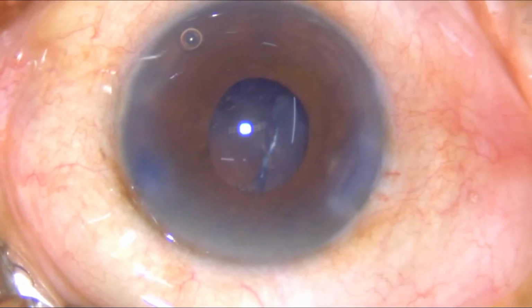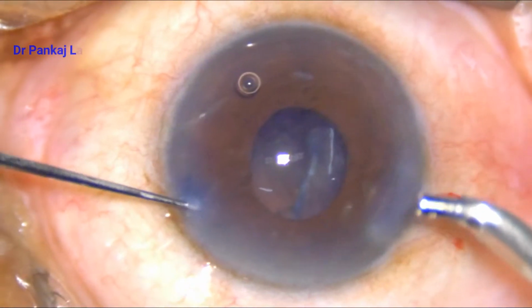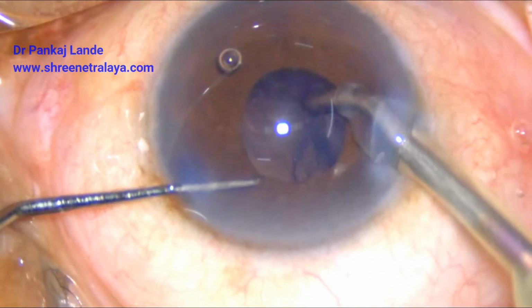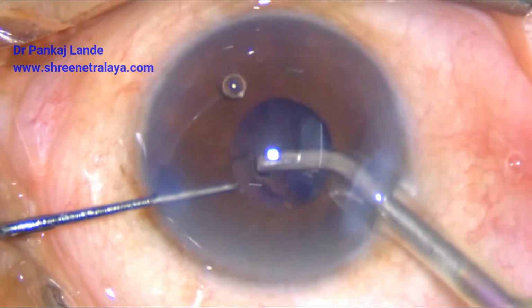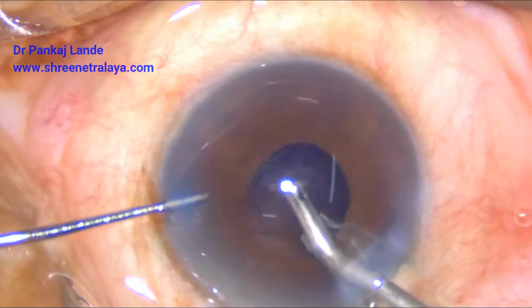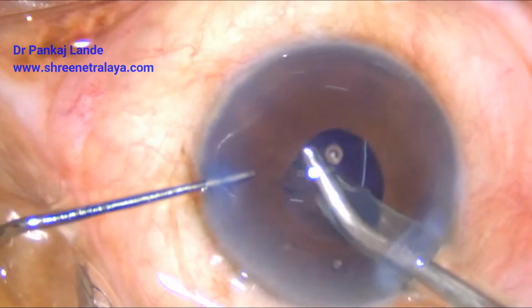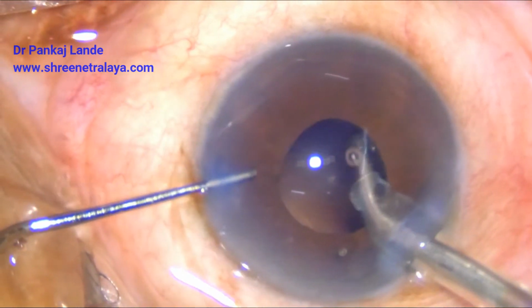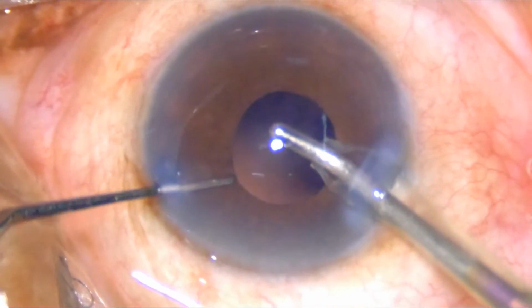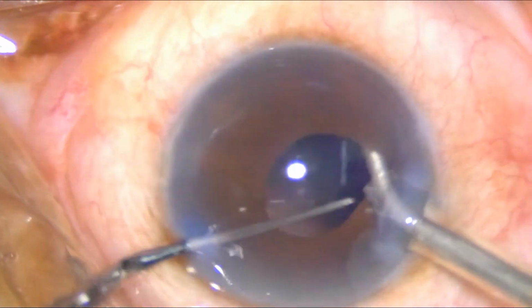While doing irrigation aspiration in a small pupil case, it is good practice to have an angulated IA probe. Go in, and do not try to take cortical matter at one place. Swipe the IA probe horizontally so that it gets a good enough grip of the cortical matter and you can take it up. You can use your left hand instrument to check whether any cortical material is left behind.